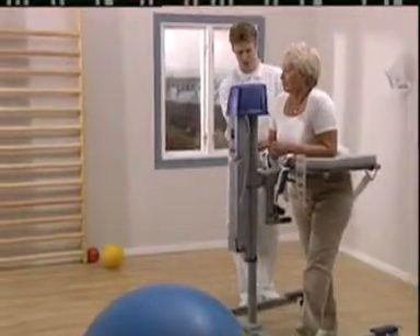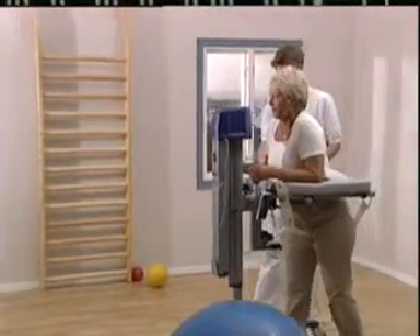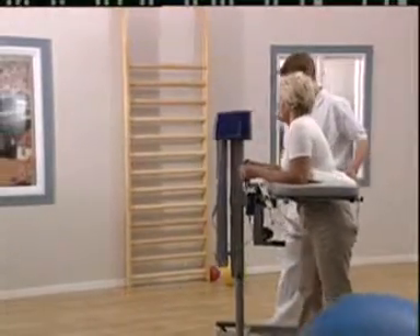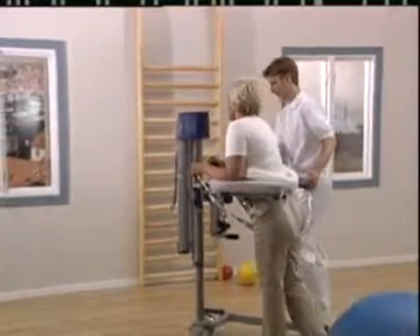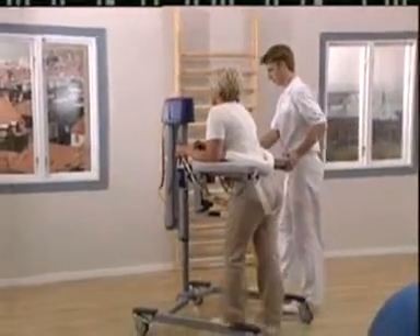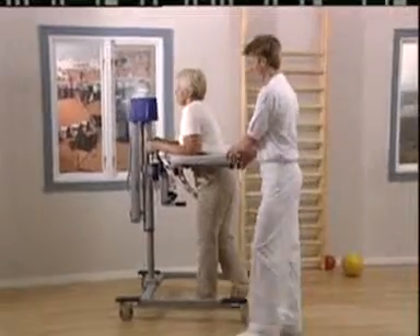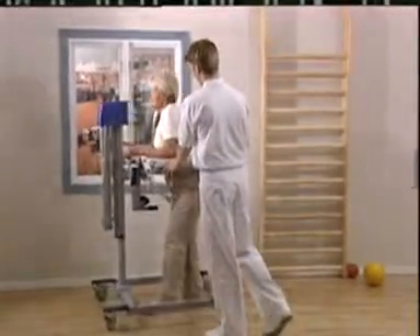The walker provides the optimum conditions to take that first step — a safe environment for both patient and therapist. The walker goes on to play an important supporting role every step of the way during the early stages of rehabilitation and ambulation training.